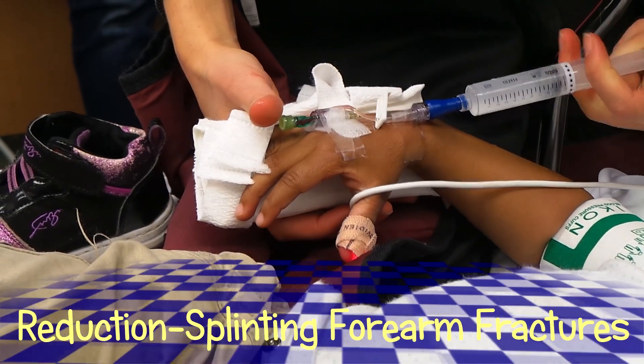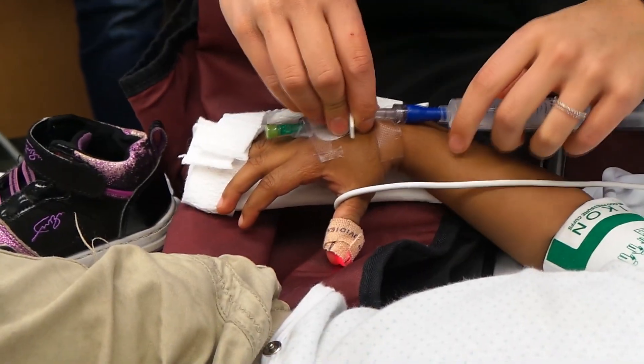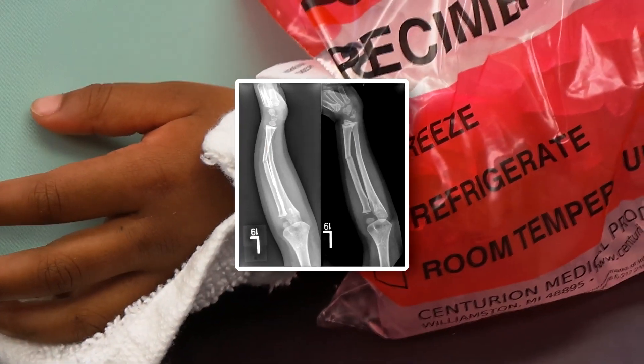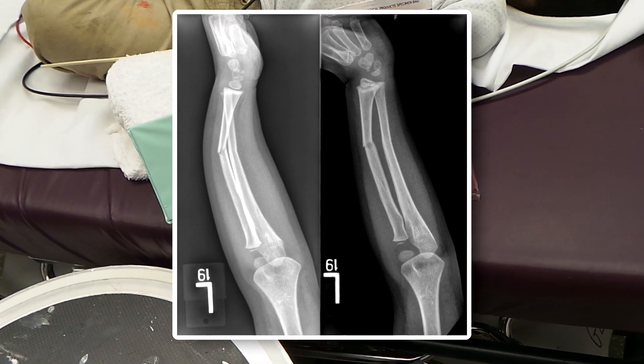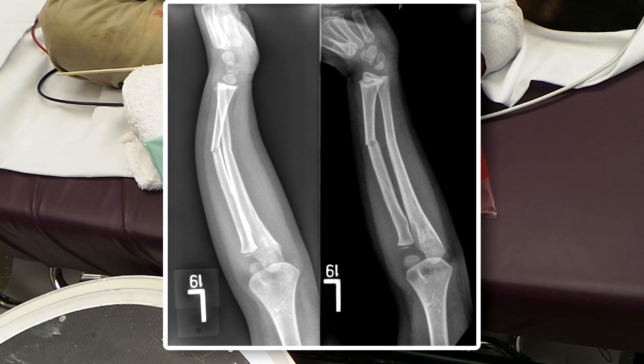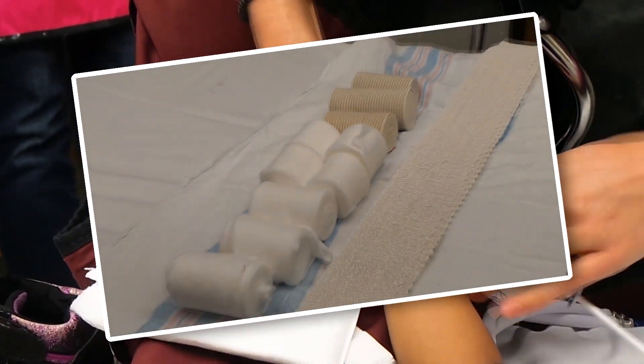Checking the IV out, and then we're going to be doing some ketamine — about a milligram per kilogram. This little girl has a fracture of two bones, kind of mid-shaft of the radius and ulna, after she fell today. We did the time out, so a milligram per kilogram of ketamine is going in.